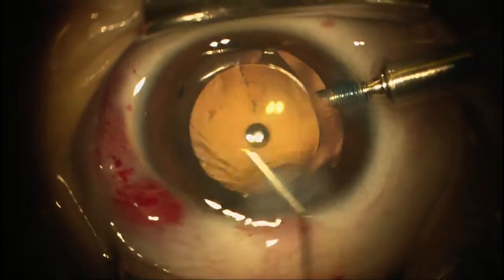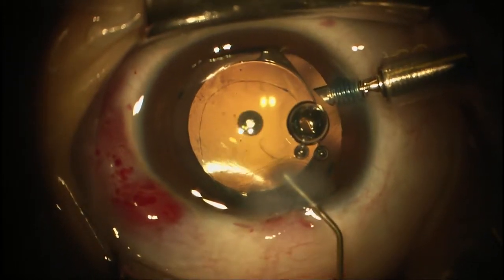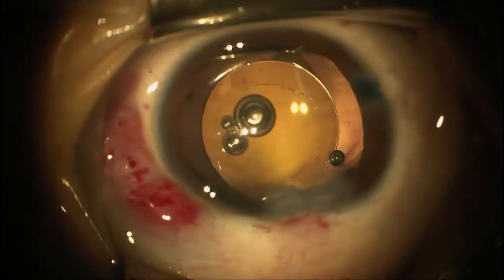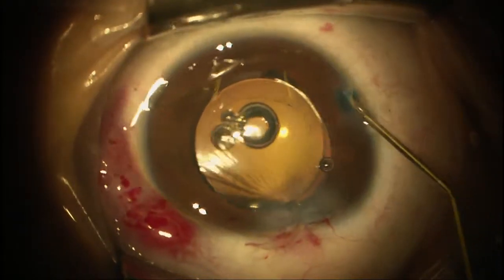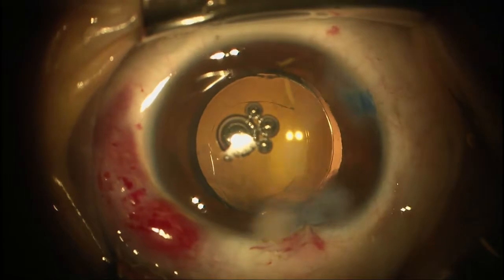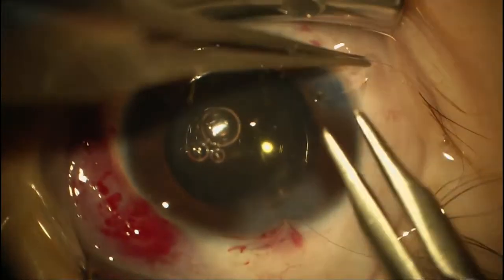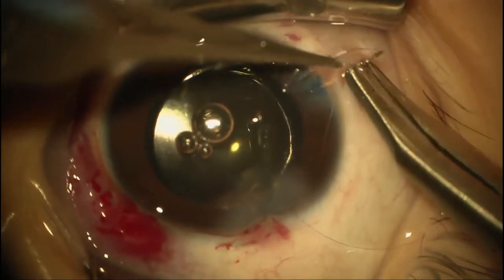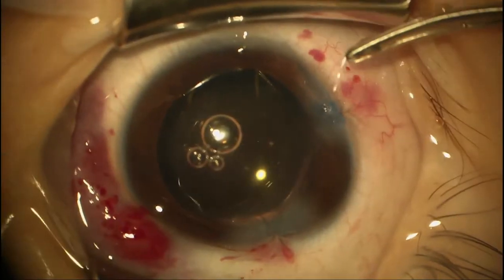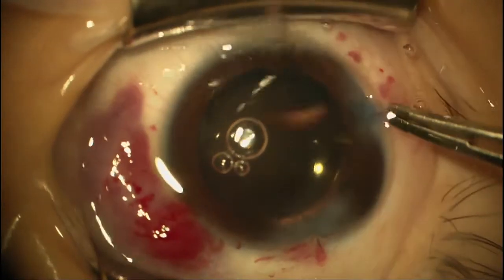We're injecting the Miochol — got a little air bubble but we're fine. Starting to bring our pupil down. I'm going to take the infusion out now, take a 10-0 Vicryl, and put in our last suture. The chamber likes to come forward. This 10-0 Vicryl spares you from sutures that break or are too tight — it's a great suture for pediatric cataract surgery. We're closing all of the incisions because of the tendency for leakage. Post-operative medications will be antibiotic four times a day and a topical steroid every couple of hours for the first couple of weeks.